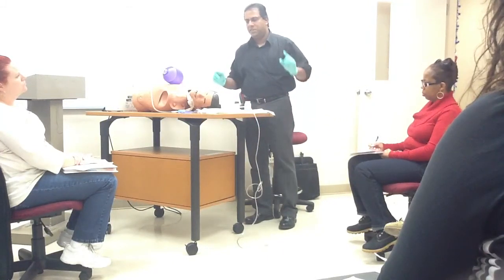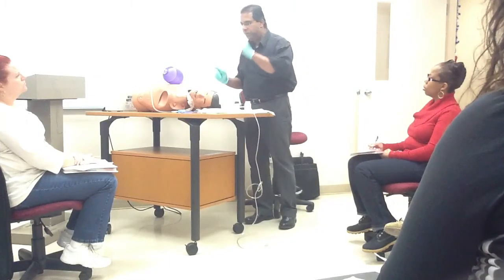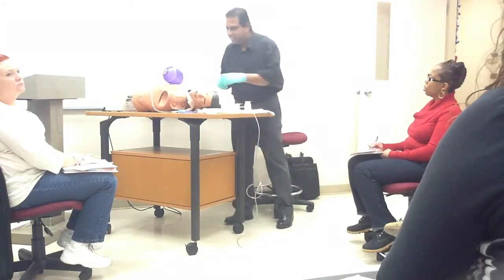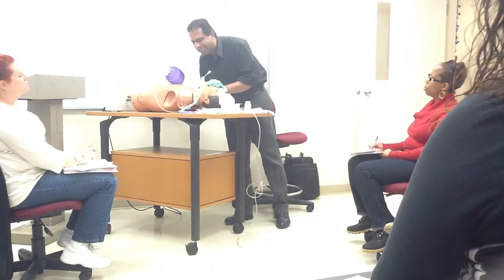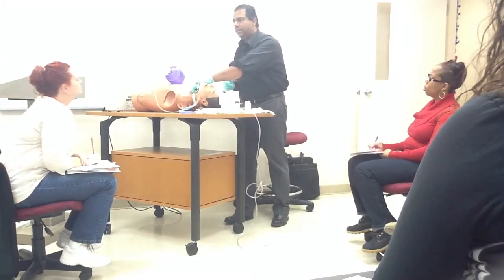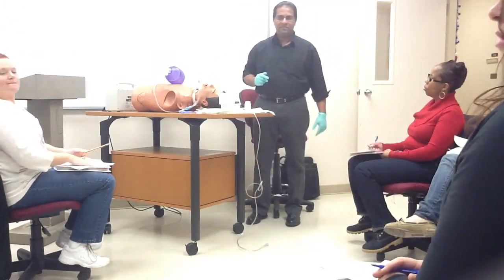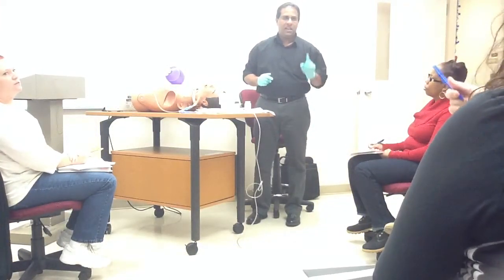Now, this is where the important question comes in. What size of suction catheter should I use for that trach patient? Oh, we went over this last night. You take the size of the trach and you divide. Let's pretend the size of the trach is 4. Okay, and this trach is number 8. So we said last night, we divide it by 2, take half the size.